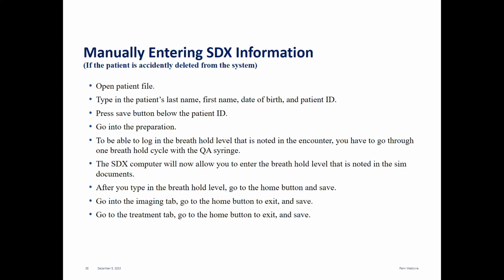After you type in the breath hold level, you can go home and then save it. But then you have to go back into the imaging tab, because remember, under the imaging tab, you did the whole training process. You trained the patients what to do, made sure they could do it. So you just have to click in the imaging tab.